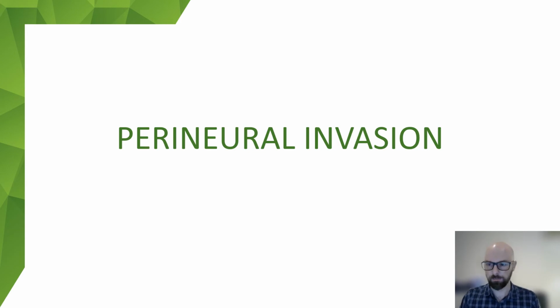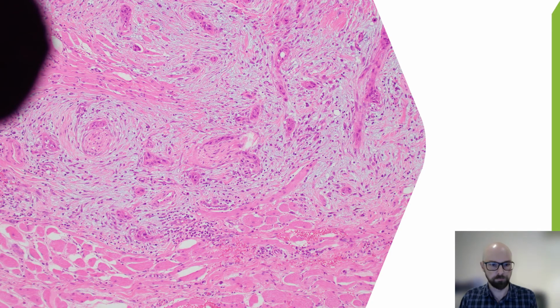Perineural invasion, it's associated with poor local and regional control of the tumour, and it does guide decisions regarding the therapy. So picking it up, typically what I tend to see is it's around the peripheral border of the invasive front of the tumour, like lymphovascular invasion. And PNI, it's reported regardless of the nerve size involved. So this one here, it's a small nerve with a little bit of tumour wrapping around it here. I do tend to document the size of the nerve involved.